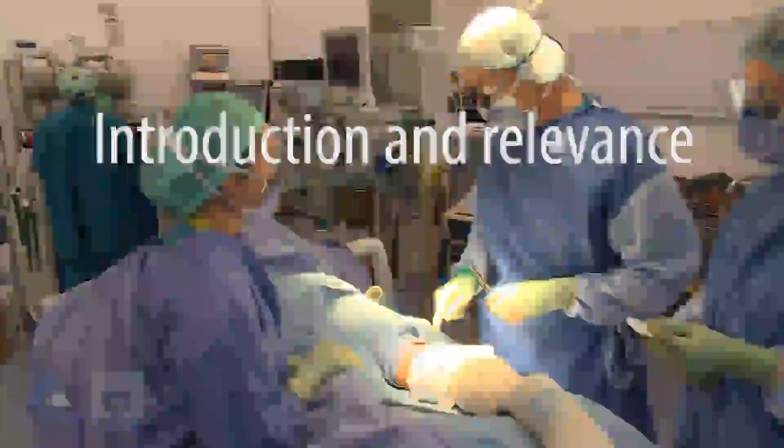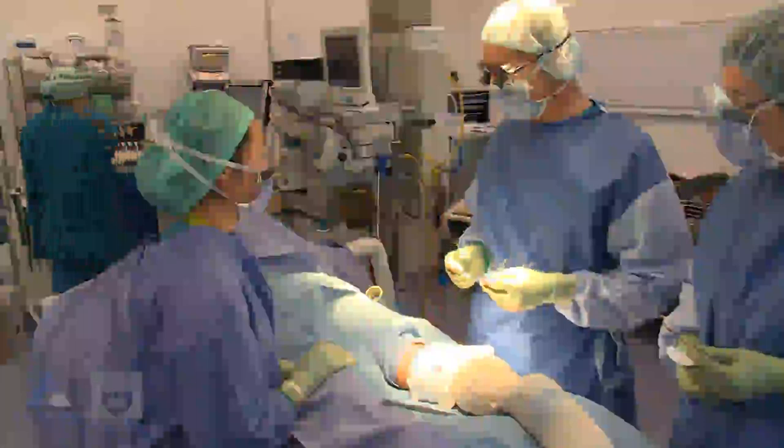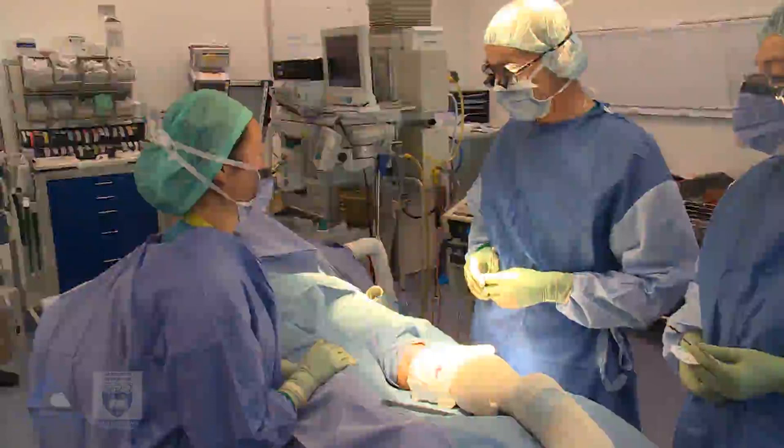Alright Jenny, we're going to put a stitch in this wound here and I'm going to teach you how to do a vertical mattress suture. Have you ever done that before? No, I haven't done a vertical mattress suture before. I've done other bits of suturing but not this particular type.